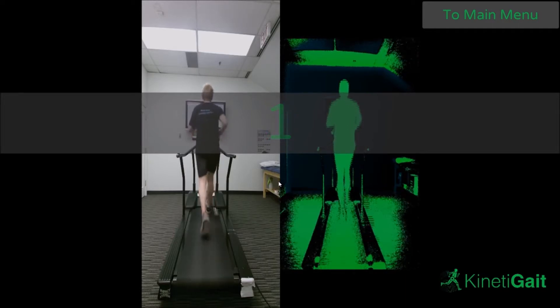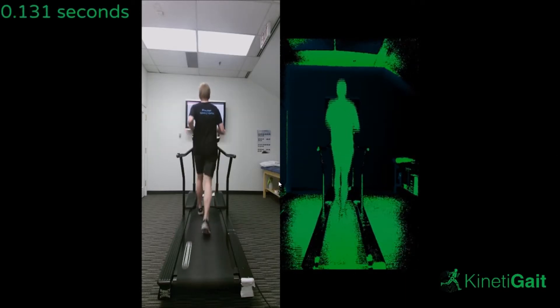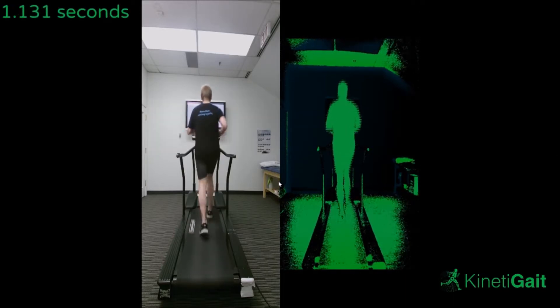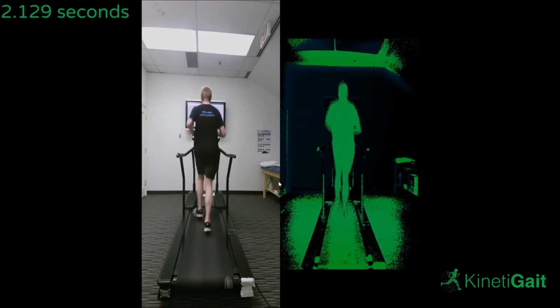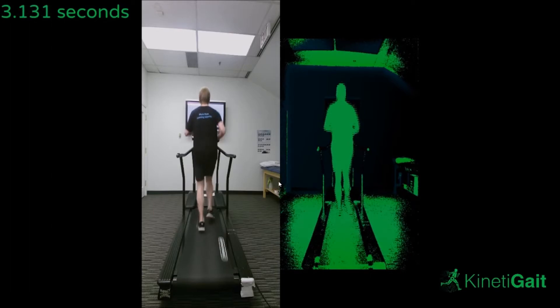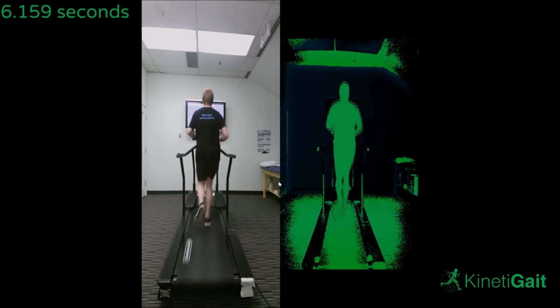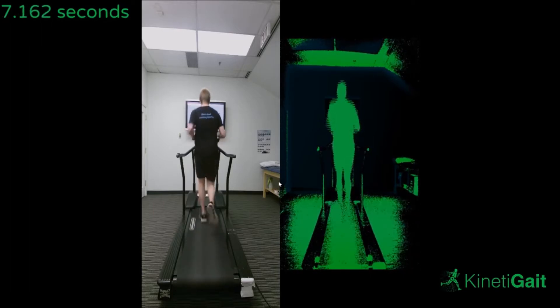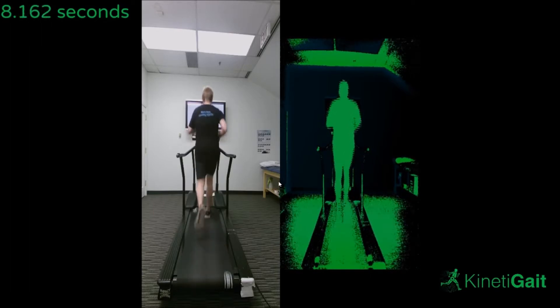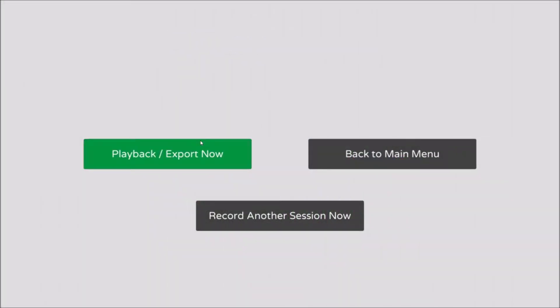Once the calibration procedure is complete, have your subject run at a comfortable pace. Provide some time for them to adjust to the treadmill, then press Start Recording. The system will then record your subject's three-dimensional data for the specified time. You will then have the option of recording another session or exporting the data you just recorded.